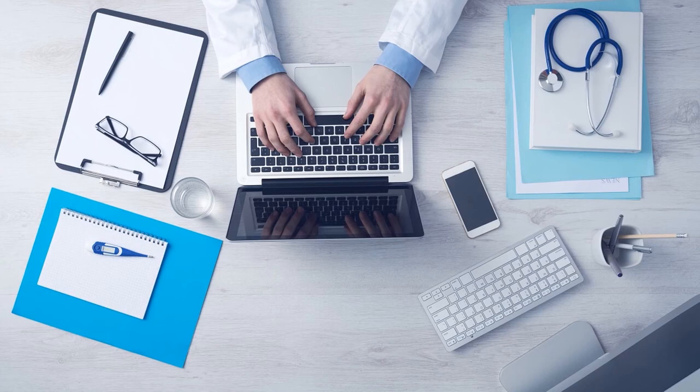Additionally, this exam does not, again, indicate the necessity to go directly to the OR. So if you have a stable patient with a positive FAST exam, you may end up doing further scans, such as a CAT scan, to find out where that injury is. If your patient is unstable, however, and has a positive FAST exam, that would be an indication for operative management.